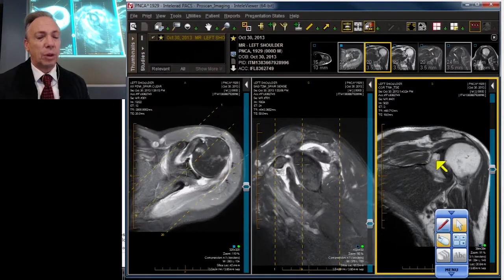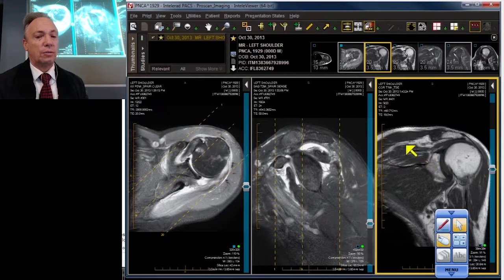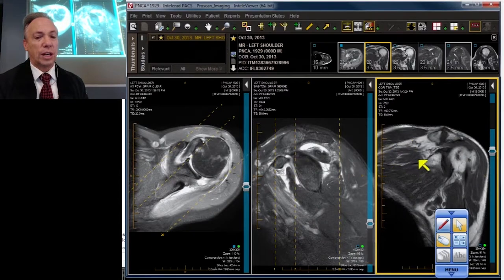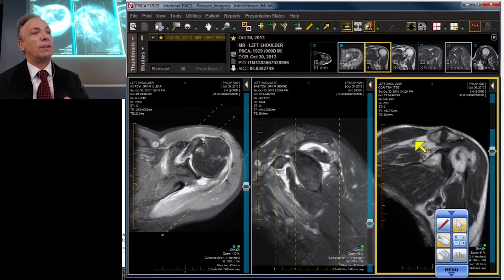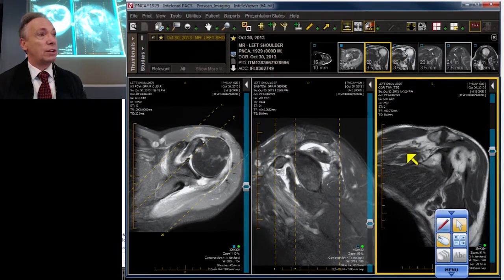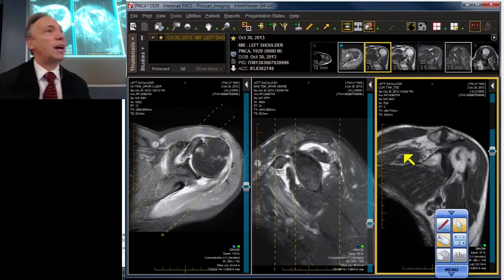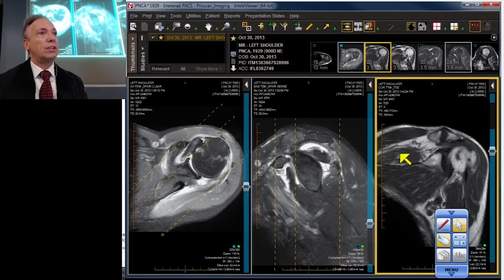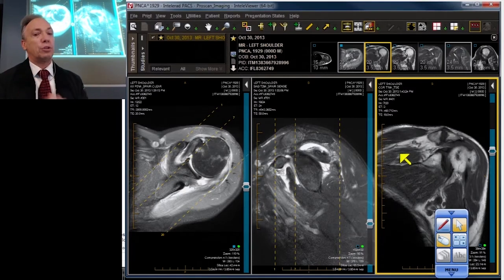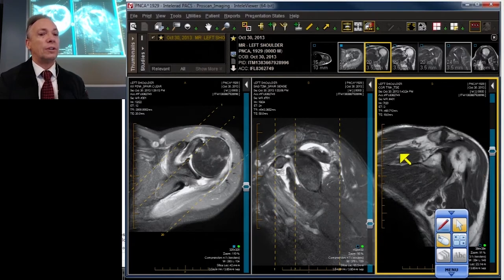Now volumetrically, I will admit that that is a subjective evaluation. For instance, this supra and infraspinatus — here's the infraspinatus — should fill out this entire space; there should be only slits of fat left. So I would call this moderate to marked, or at least moderate. The amount of fatty infiltration can be compared with the trapezius to use it as a reference point, and I would say there's at least mild, perhaps mild to moderate fatty infiltration. But I always try to make that distinction for the surgeon. Most important is when it's volumetrically severe, and even more important than that, when the fatty infiltration is severe — those patients are often unsuitable for surgery.